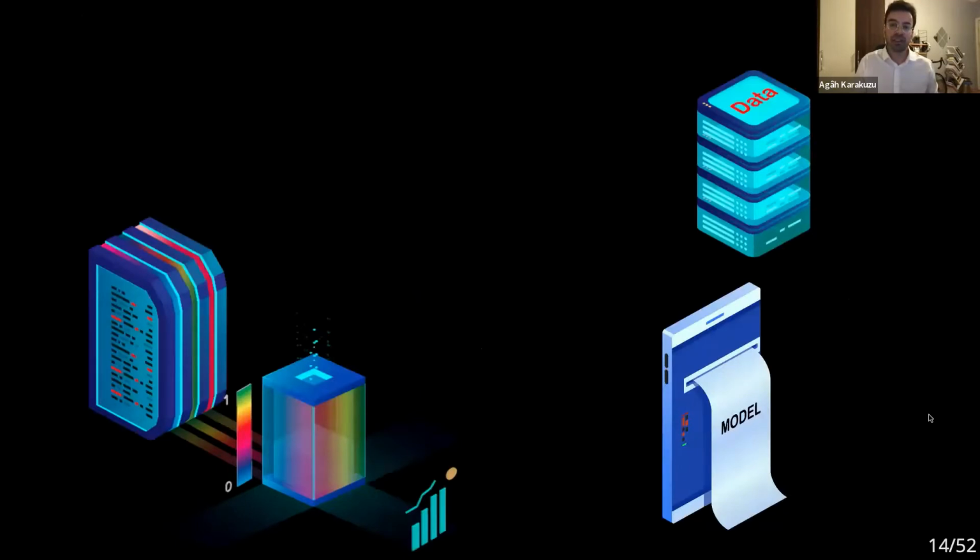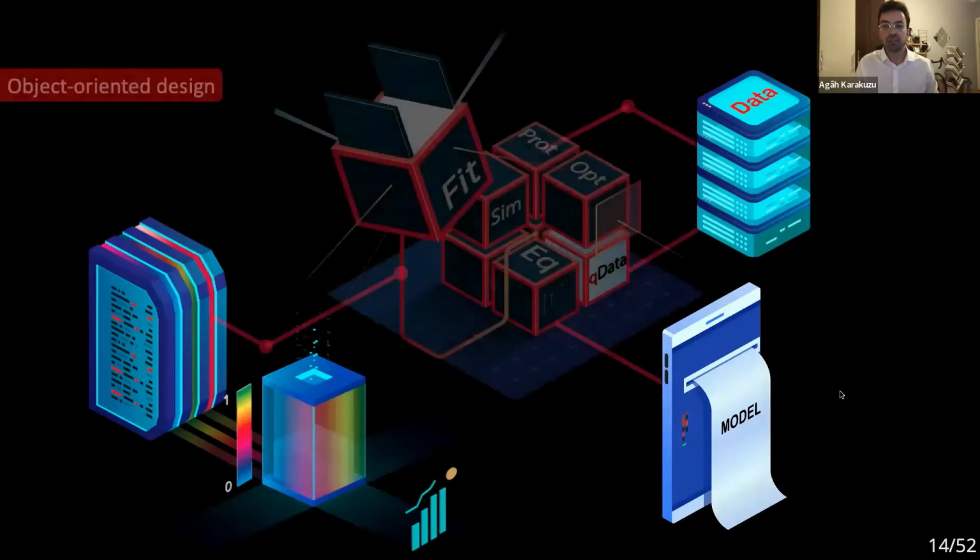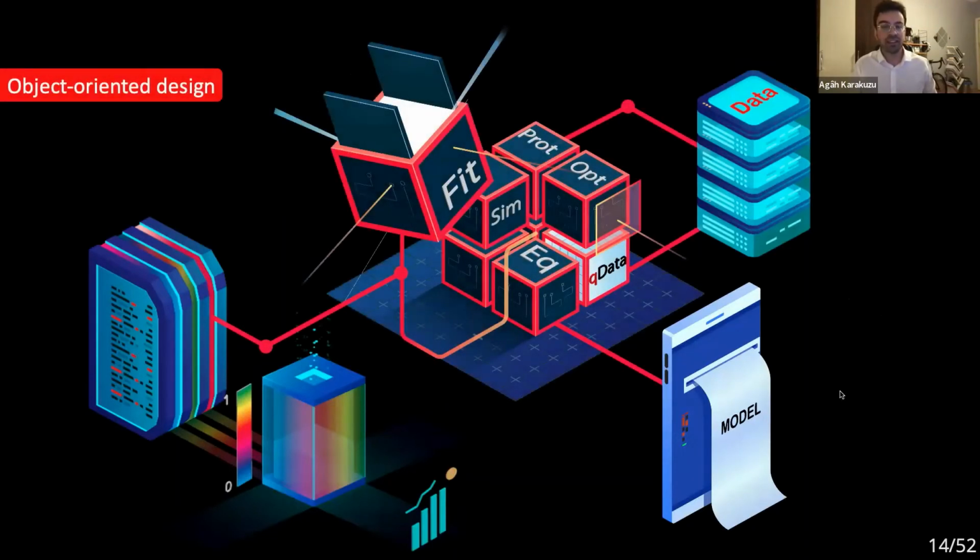To bring together data, model, and processing in relation to quantitative MRI methods, we developed an object-oriented design. Each qMRLab object builds all the necessary attributes and methods to fit and simulate quantitative MRI data based on this abstraction, which offers modularity and easy development.